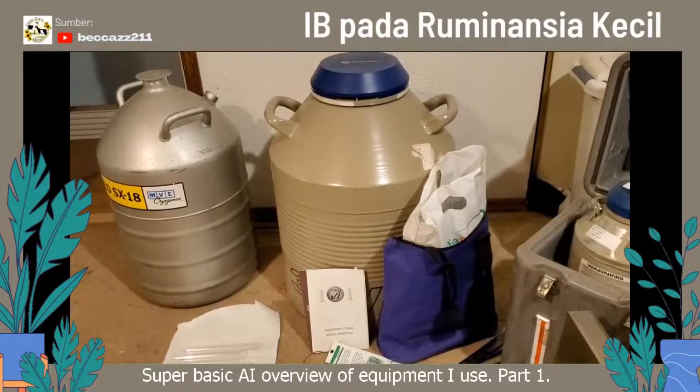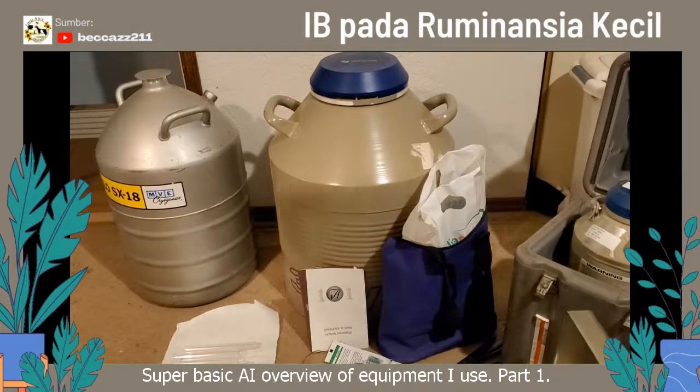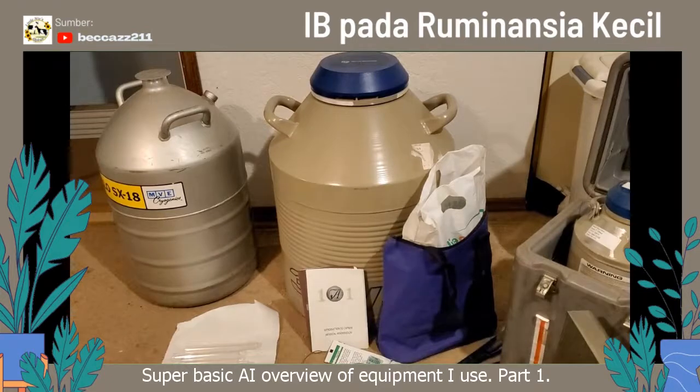I was asked to do a video about AI. I'm not really going to cover a lot of detail — it's going to be very brief, more of an introduction to equipment. I want to preface this by saying this is what I use. This is equipment that I like. There are lots of different options out there, but I'm only going to show you what I use and what I like. We're going to break this into two sections.